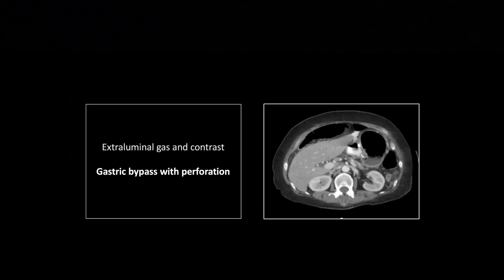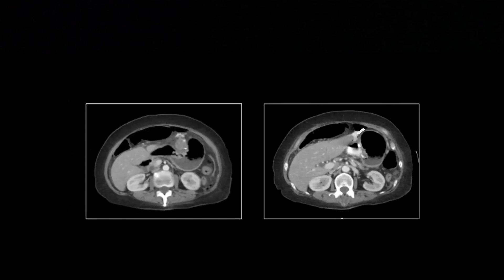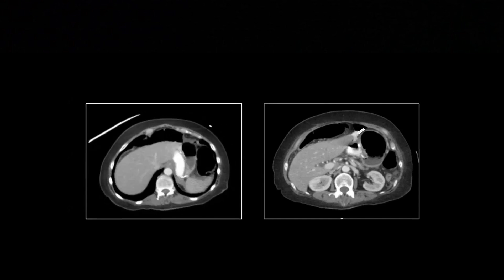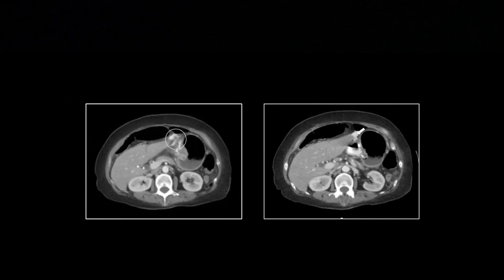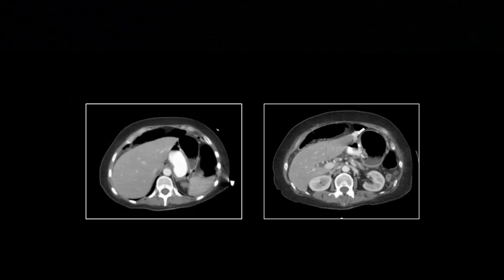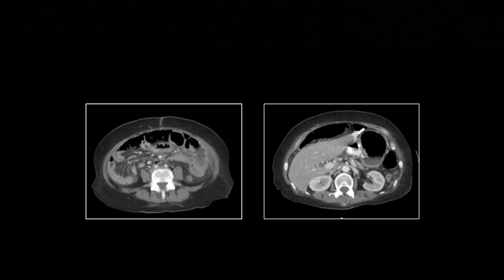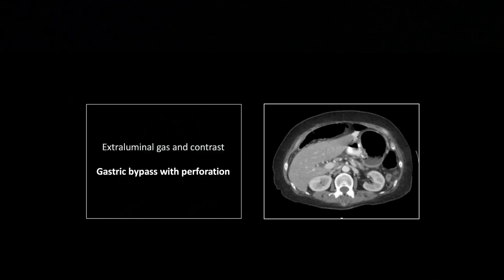Here is the more frequent perforation scenario. I had to choose between three to five cases at this exact location — where the efferent loop originates it is exposed to more gastric acid than it is designed to handle, making it a fairly common site for ulceration and perforation. You can see a collection of extra-luminal gas and contrast right at the origin of the efferent loop. There is also small bowel wall thickening, as gastric acid in the peritoneum causes all bowel loops to become thick-walled and enhancing.